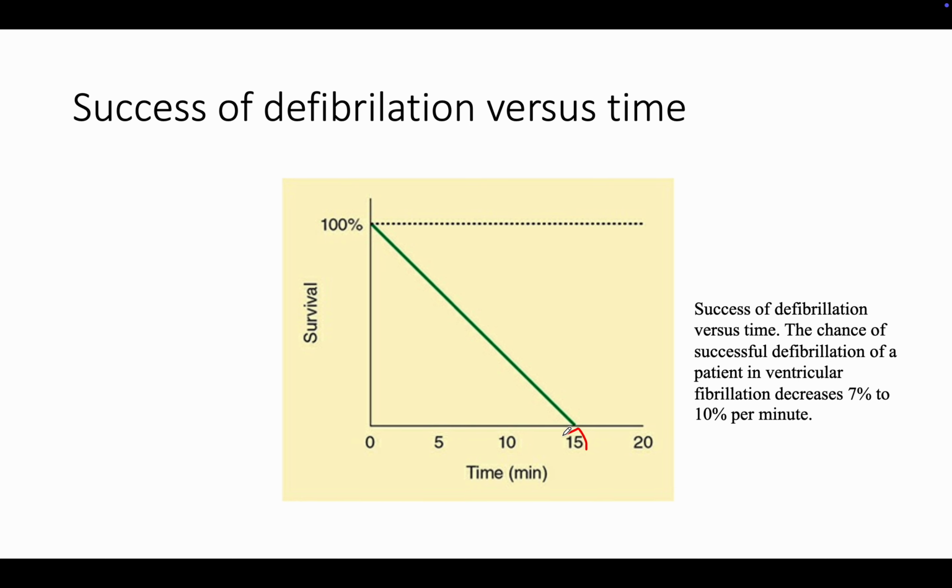After 15 minutes, there is no survival. No one has survived in this one. If we give it earlier, there is around 100% success, and it decreases like this.